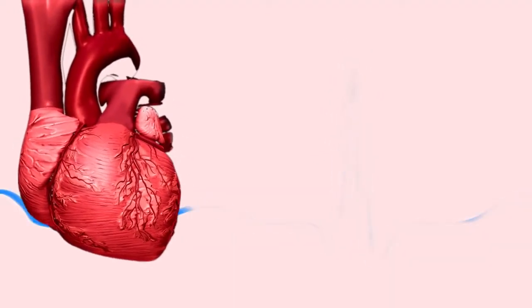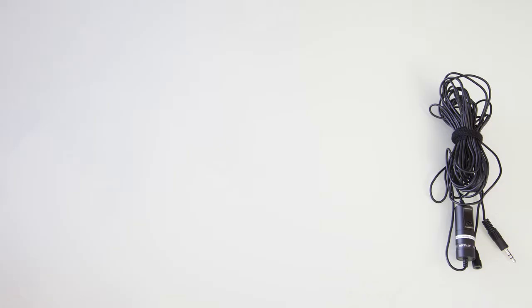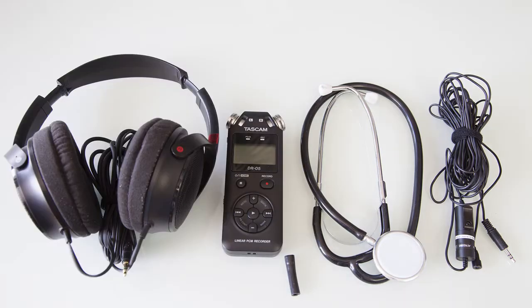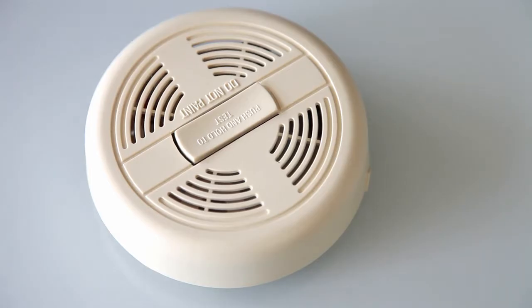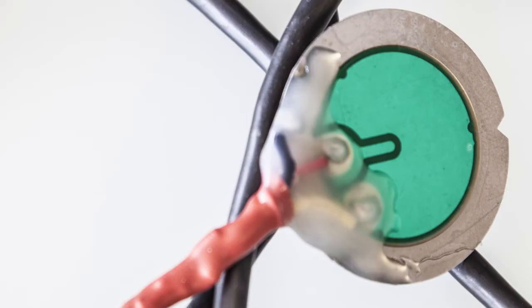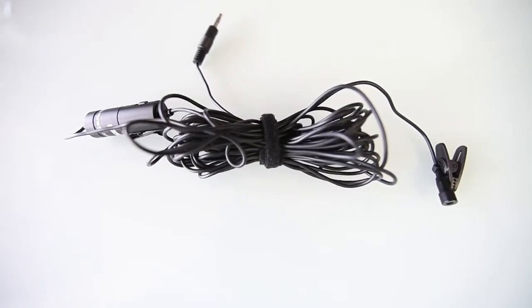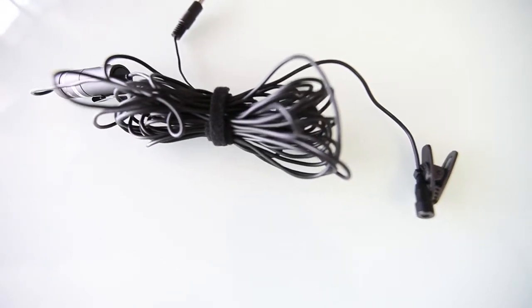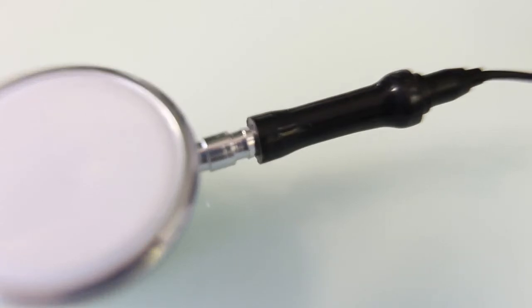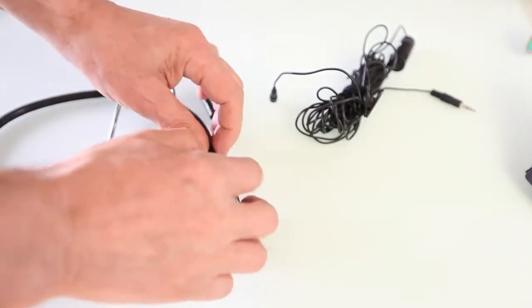Recording heart sounds is relatively easy. You will need a good microphone capable of recording low frequencies, an inexpensive stethoscope, a recording device and headphones. It is also possible to use a piezoelectric buzzer or transducer as a contact microphone. I took it from an old smoke detector. The stethoscope is not necessary if you will use the contact microphone. I tried both and discovered that the condenser microphone combined with the stethoscope worked better than the contact microphone.